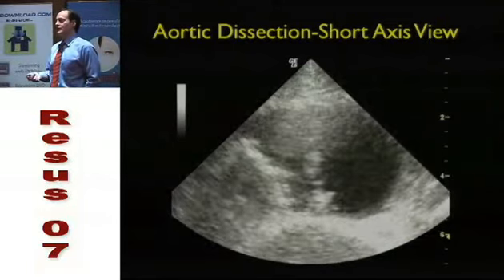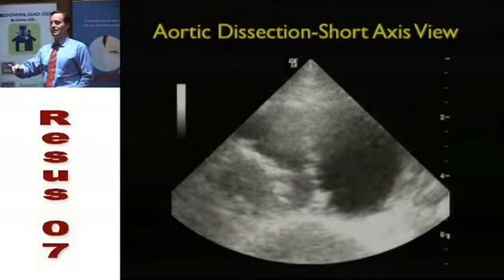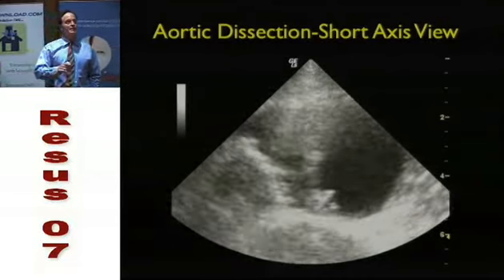And I know it's very confusing, the DeBakey versus Stanford class, but I actually don't like the DeBakey because those 3 classifications make me nervous. The Stanford class, this would just be a B.